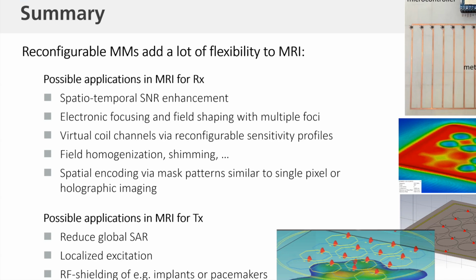So you have one receive channel, or one ADC, analog to digital converter, in the scanner, and you multiplex it, sort of. Yeah, you are using the temporal dimension to get the different encodings. Like you do with gradients. Yeah, you are also getting the different patterns over time by applying your gradient.